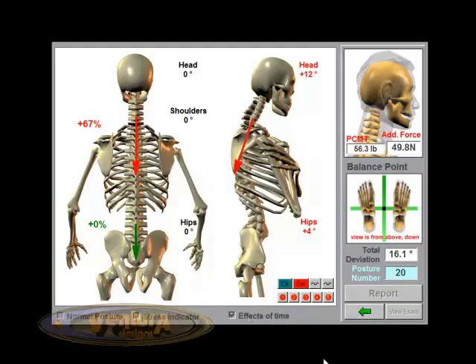This screen also has a modified version of the drawing tools in this lower right hand corner, where you can draw freehand lines, for example, to highlight different areas, and put little markers on the screen, again, to highlight different information that you're relaying to the patient. Now on this stress view, at this moment, only the lateral skeleton is doing any moves, because we only did a lateral exam. When we do a front-facing exam here in just a minute, we'll come back to this screen. You'll see how both of the skeletons will become engaged. Any questions about this screen?